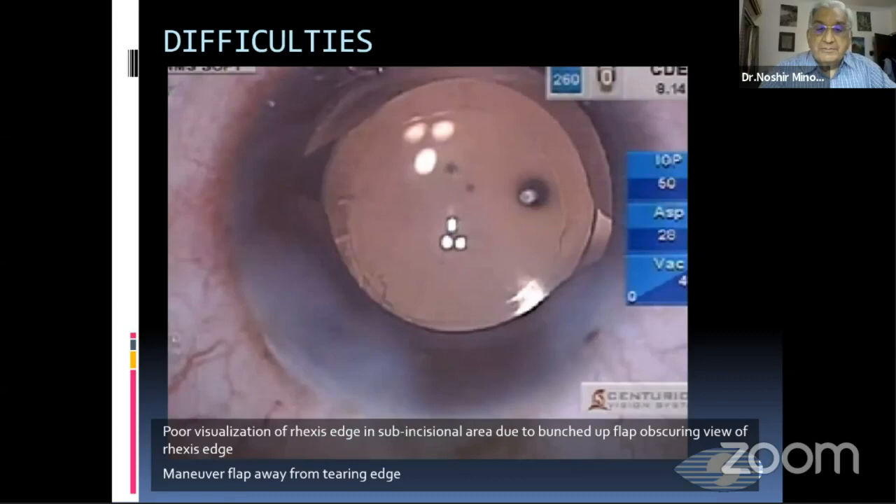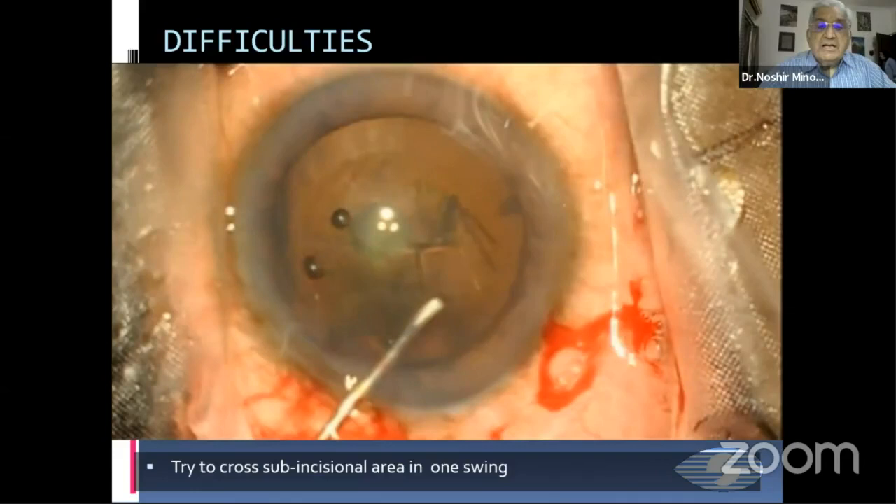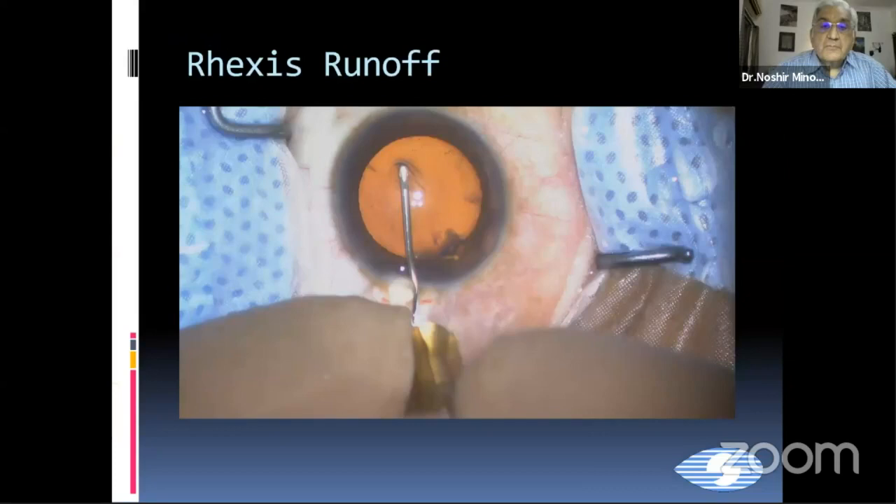And this is how it comes if you un-munch it. Secondly, you should try to cross the sub-incisional area with one swing, because it is a sub-incisional area in which the capsulorhexis is not very easily visible. And therefore, you should see that you cross it in one swing.